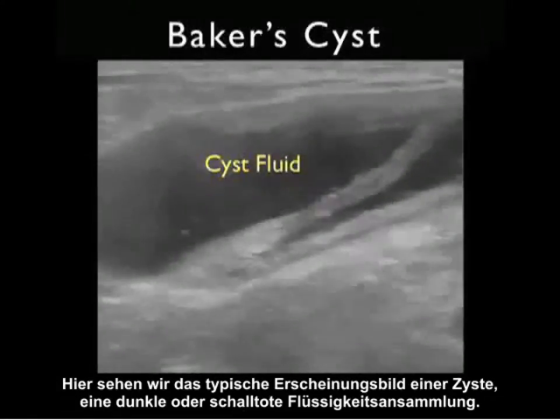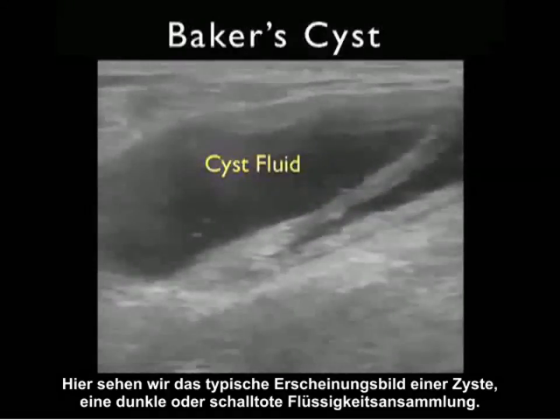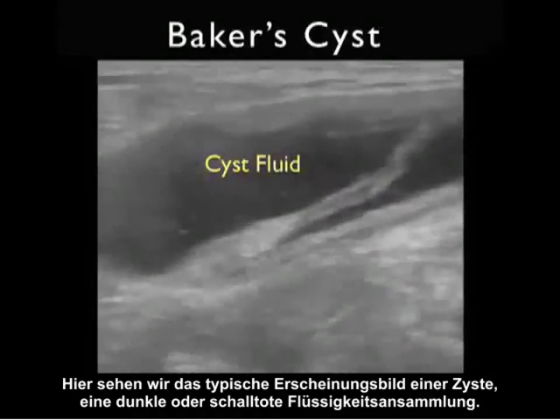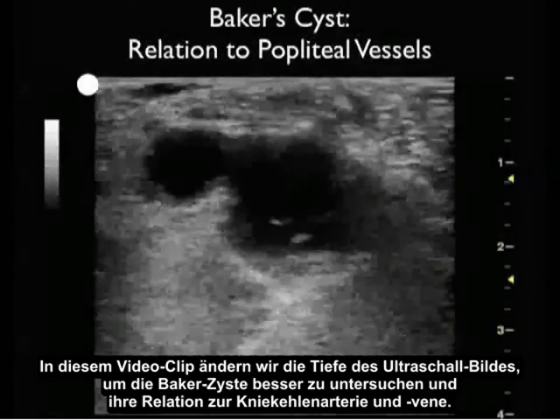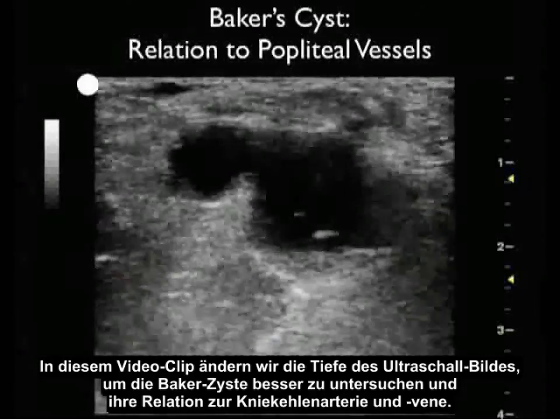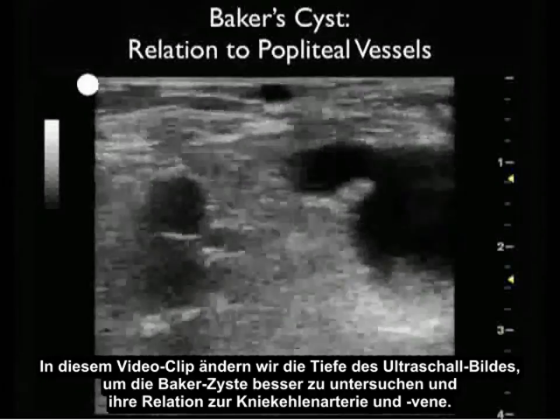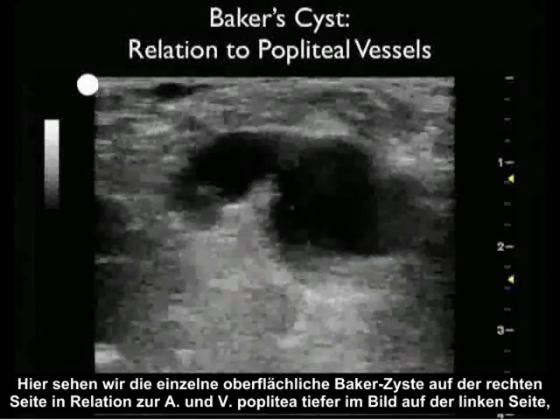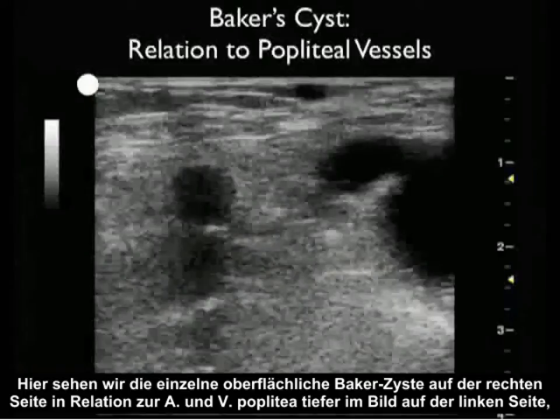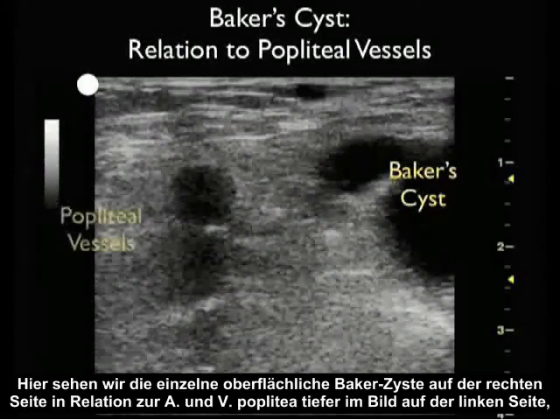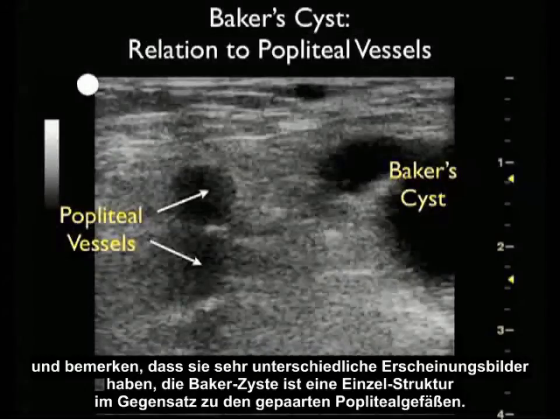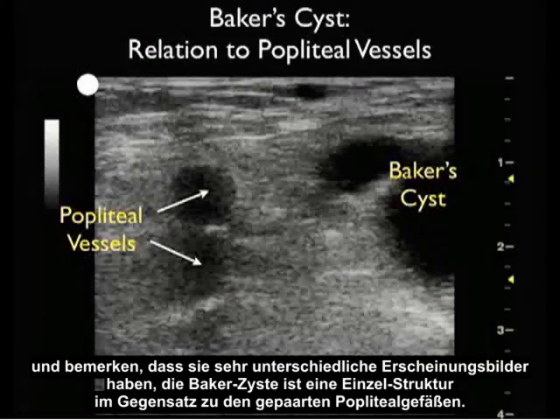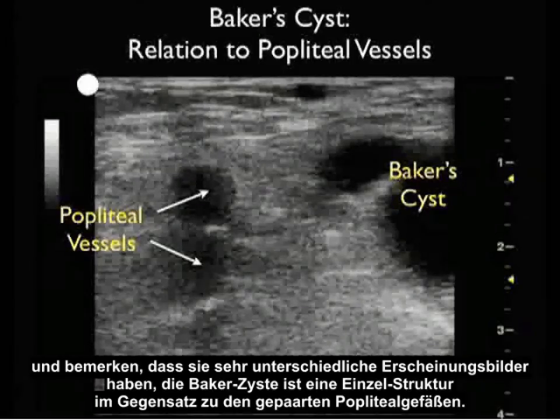Here we see the typical appearance of a cyst — that is, a dark or anechoic fluid collection on bedside sonography. In this video clip, we're going to change the depth of the ultrasound image to better interrogate the Baker's cyst in its relation to the popliteal artery and vein. Here we see the single superficial Baker's cyst to the right in its relation to the popliteal artery and vein seen deeper on the image and to the left. Note that they have very different appearances — the Baker's cyst is a single structure in contrast to the paired popliteal vessels.